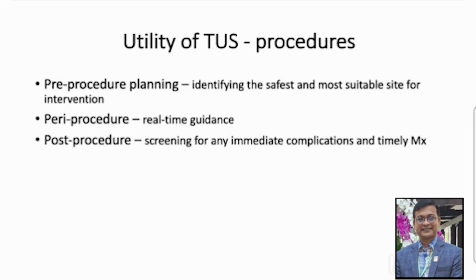So while doing the procedures, we can plan a pre-procedural plan, that is which site is most suitable for doing the intervention. During the procedure, real-time imaging is possible, so we can make the intervention easier and safer. And after the procedure, whether there is an immediate complication, we can diagnose and detect by doing the ultrasonography and take timely management.